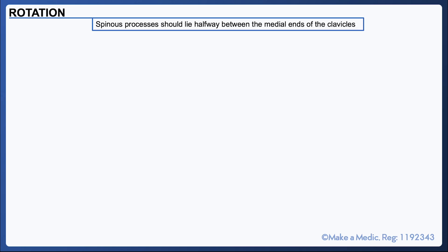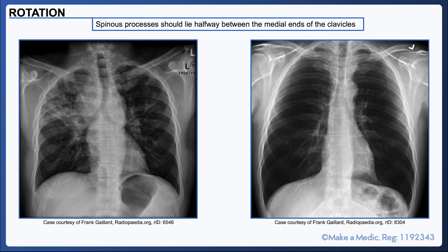Assessing the quality of a chest x-ray involves commenting on the rotation, inspiration, penetration, and exposure. First, let's talk about rotation. In a good quality chest x-ray, the thoracic vertebral spinous processes should lie halfway between the medial ends of the clavicle. On the left, you can see that the film is slightly rotated, whereas on the right, it lines up very well.